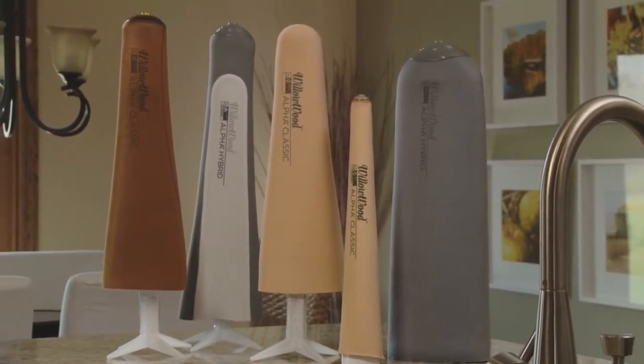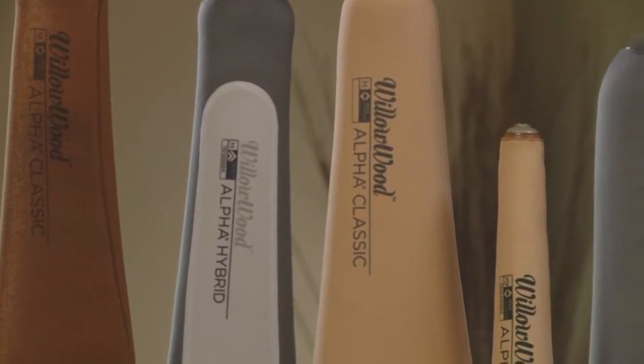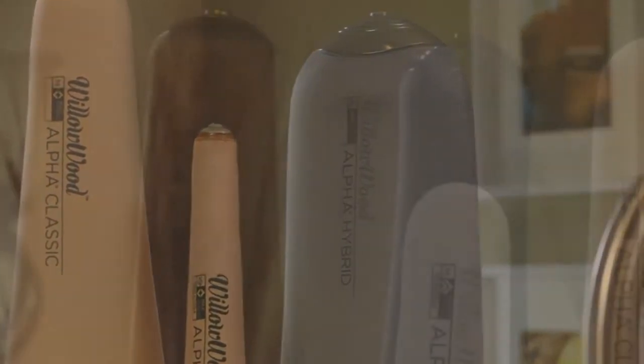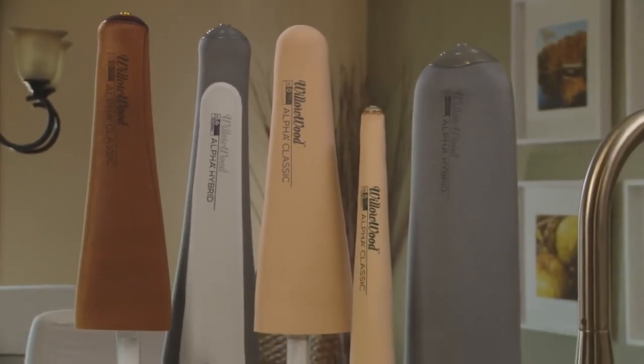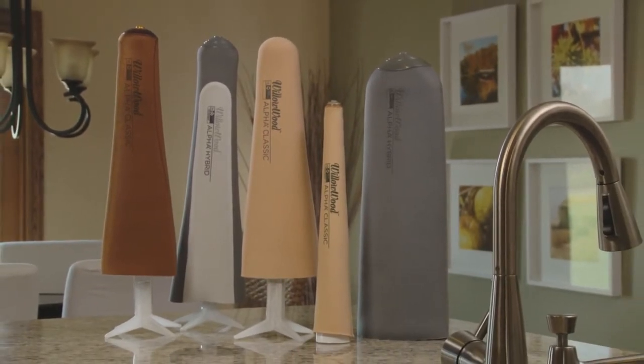We firmly believe that your prosthesis will feel more comfortable with this cushioning layer of gel to dissipate the forces applied to your limb. In order to ensure the highest level of comfort and the longest possible life from your Alpha Liner, please follow the directions in this video carefully and be sure to contact your prosthetist right away if you have any questions.